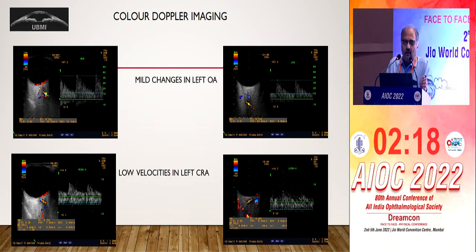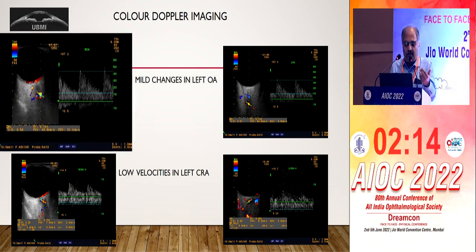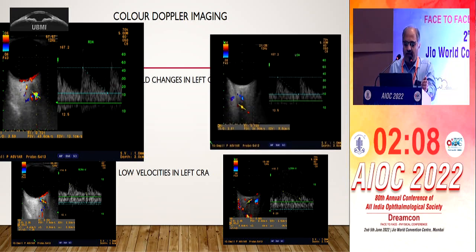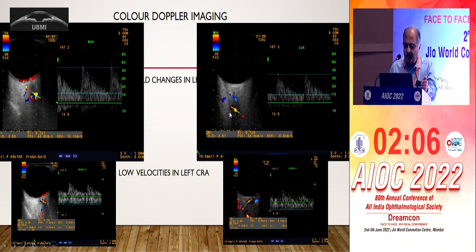So we did color Doppler of this patient here. It's color Doppler at 2 levels, at the ophthalmic artery level and at the central retinal artery level. You can see that changes happening here in the ophthalmic circulation. Here, the end diastolic values. I don't want to go into the details of these values here because it's too much for this talk, but it's 12.1 here and 9.6. Within 10 to 11 is accepted range or normal. It's a very small range of normality.